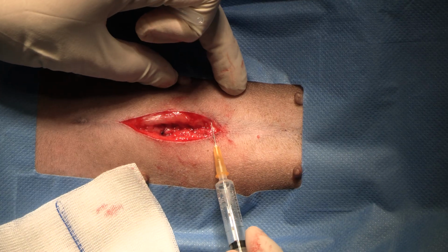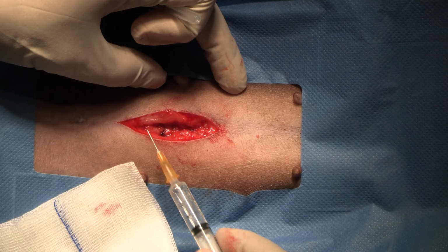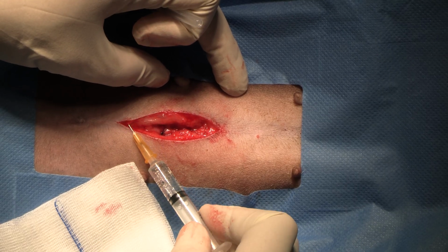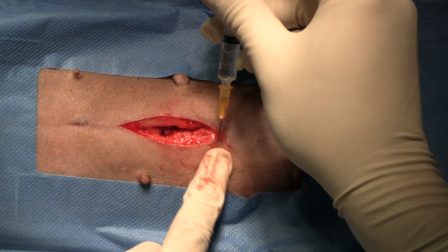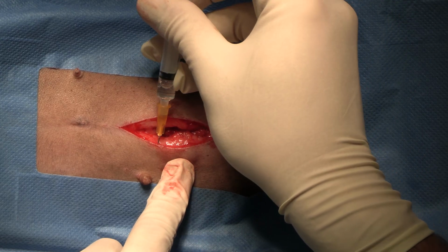So just for some additional pain relief, what we do is we put in some bupivacaine in the incision, and also place on a bit of a lidocaine patch afterwards.